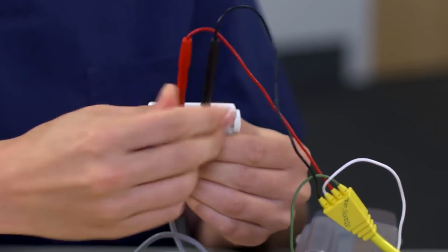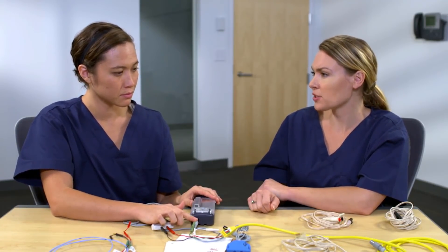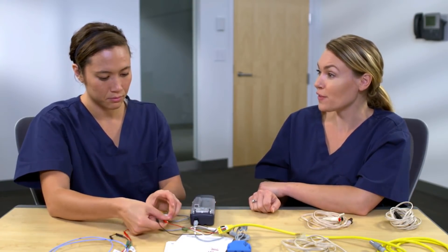Now the cables all connect the same way to the device. You just want to be sure you always hear that click and then slightly tug to make sure the connection is secure. So there is the connection of the 5433 cable with the pacing lead.